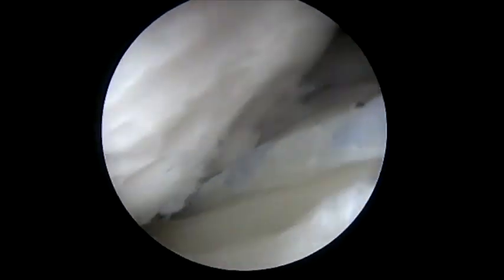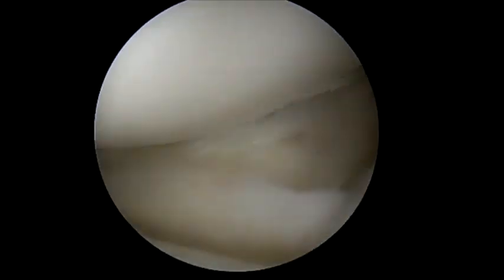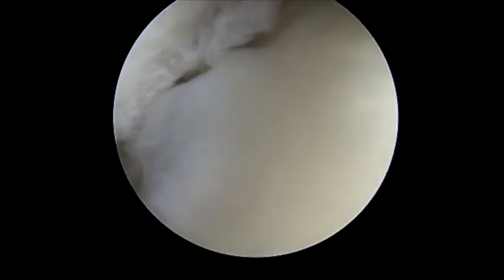This is very low profile. You can see here that once we fully engage it, the reverse HAGL is completely eliminated and we restore good tension to the inferior glenohumeral ligament on the posterior aspect.